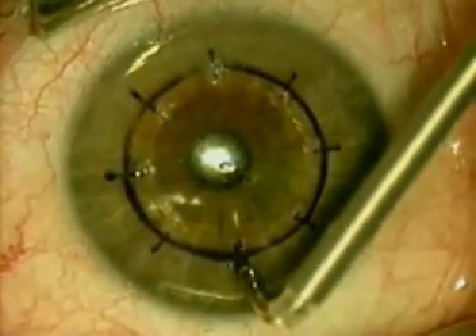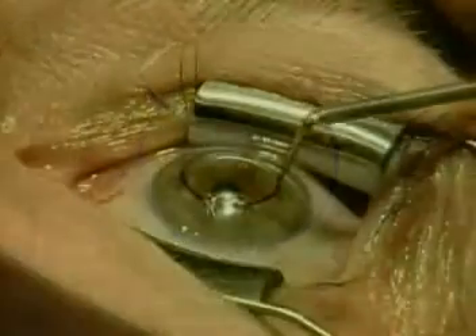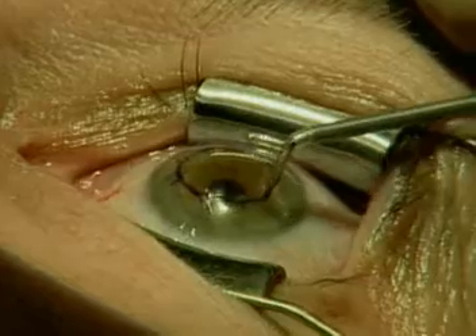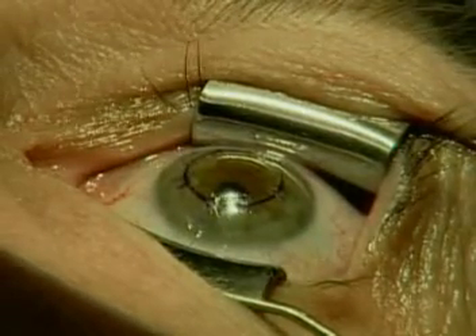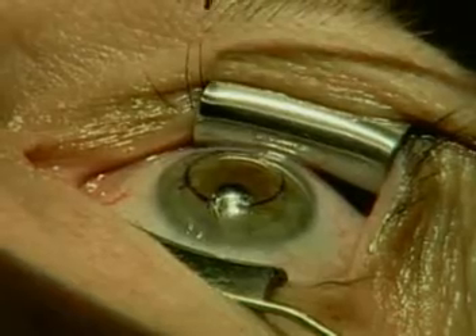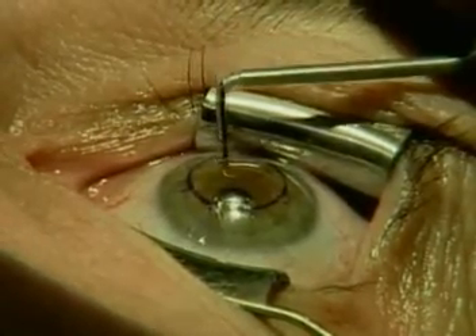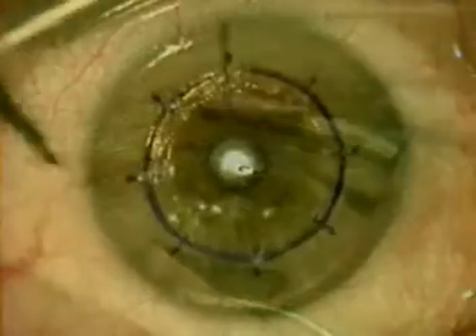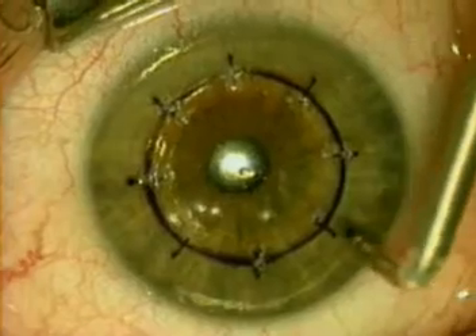The entire CK procedure can be done in less than three minutes, and we're nearing the close of the procedure here. We've seen the leucomas that form after each application — they're notable, but somewhat more faint than you'll see with something like LTK, or laser thermal keratoplasty.